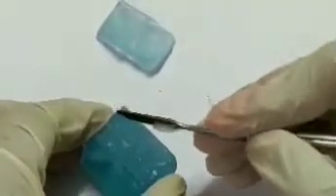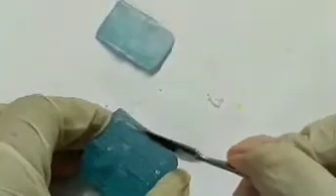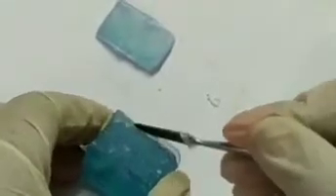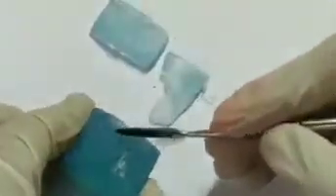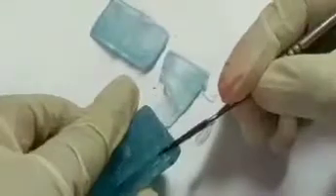The excess wax is removed beyond the outline buccolingually, and we have to uniformly remove it.